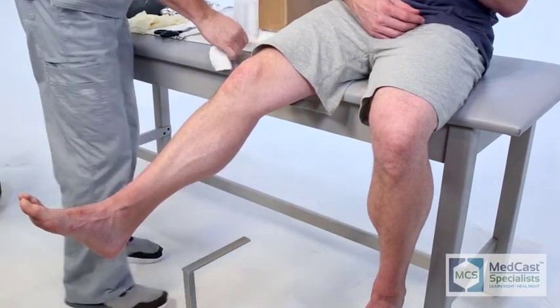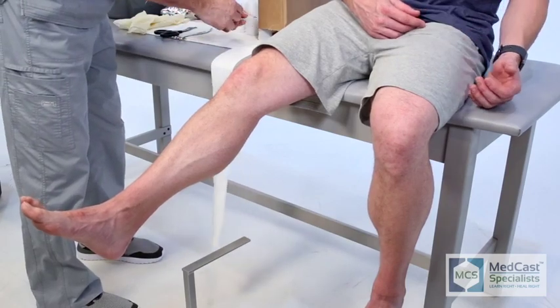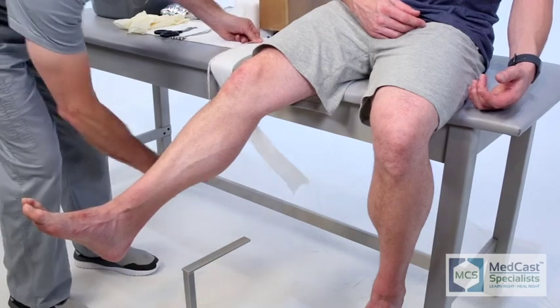In this video I'm doing something that I don't do very often, and that is actually measuring. Usually you'll just eye up the patient and the particular cast you're doing and you'll get it really close.